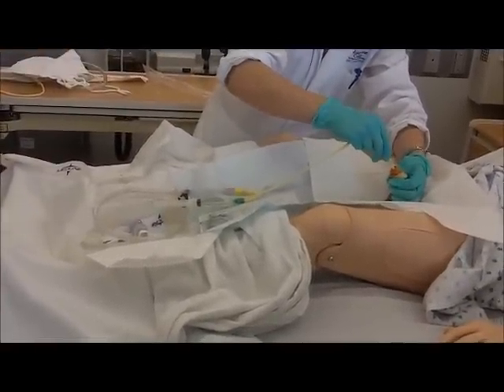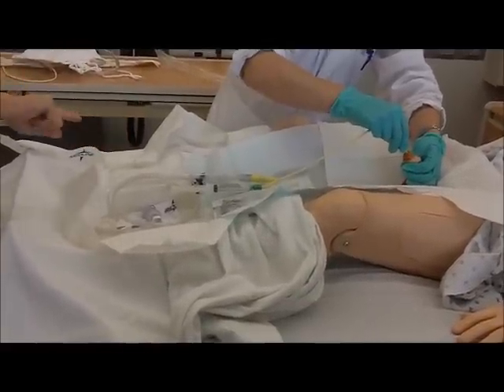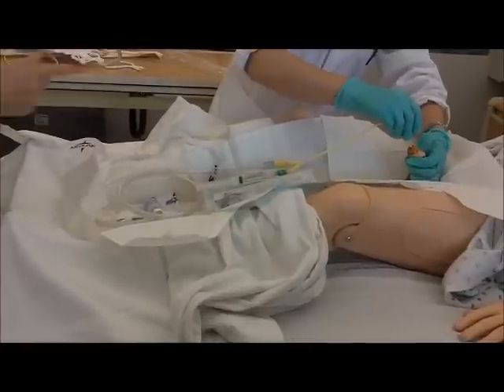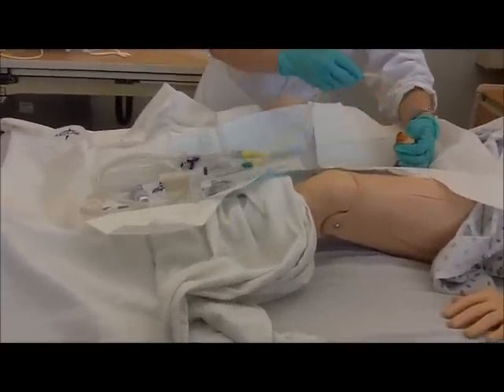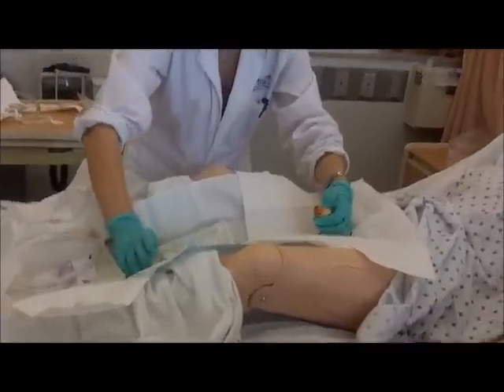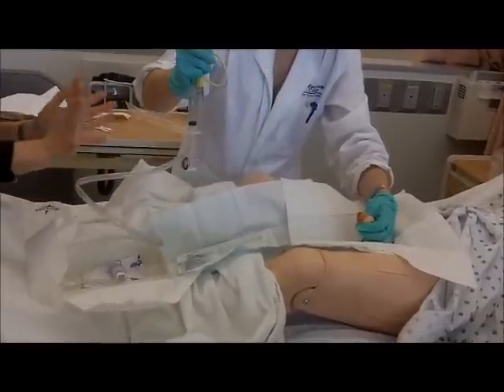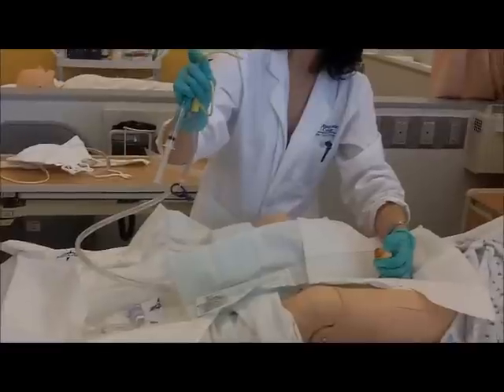See, what ends up happening is your syringe creates some weight on your catheter and could have your catheter fall, so this whole area could be contaminated. That's why I like to hold it closer. So like you wrapped it around — not really wrap around. When you start practicing and you start wrapping around, you're one-handed now, you're not going to be able to unwrap it. But if you just kind of do like she's doing right now — just doubled it — yeah, I pretty much just kind of like double it, so I have greater control.